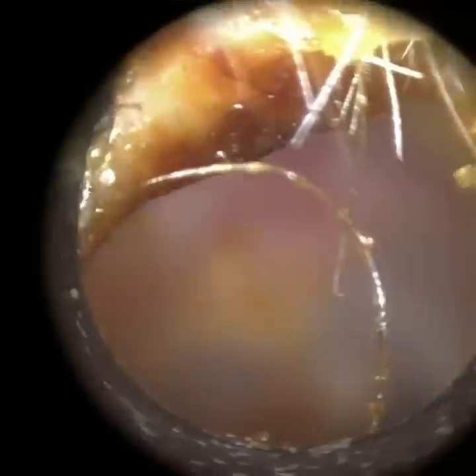Here on the right-hand side, about 2 o'clock, you can see some shiny, glossy skin. The suction probe just got blocked there. Just on the right, there's some dead skin that not only attaches to the wax plug, but it's also still semi-attached to the canal wall. This dead skin — it's almost a plain tug-of-war with us. It doesn't want to let go; it's enveloped the wax plug. Here we've just twiddled it through, just near the first bend now. I'm just going to curve it around the first bend so it comes out without much resistance.